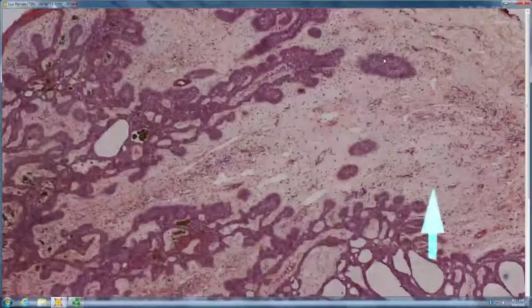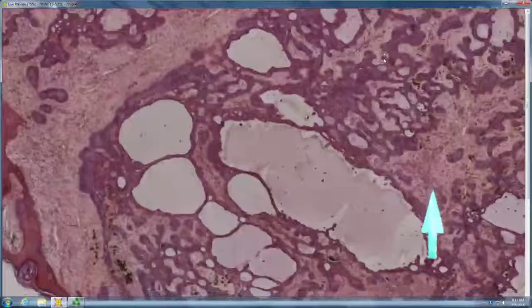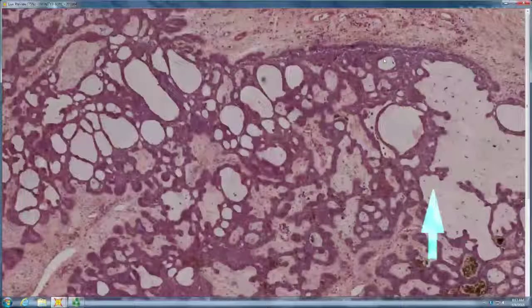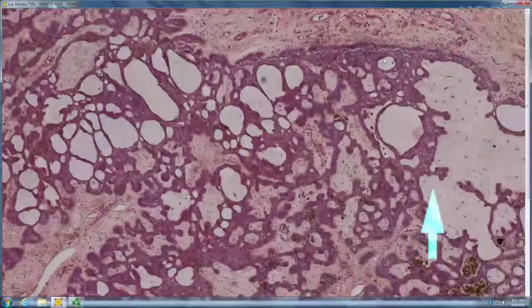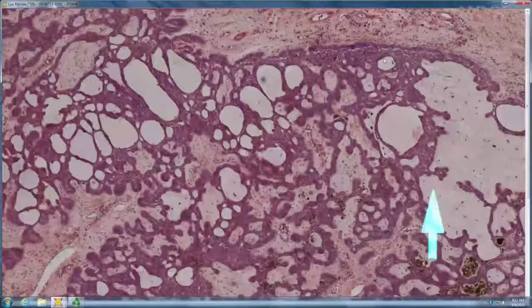It's more fibromyxoid, right? And it's pink strands with blue buds. So the type of BCC, infundibulocystic. So infundibulocystic BCC, or what pilar benign tumor looks just like infundibulocystic BCC? Basaloid follicular hamartoma.